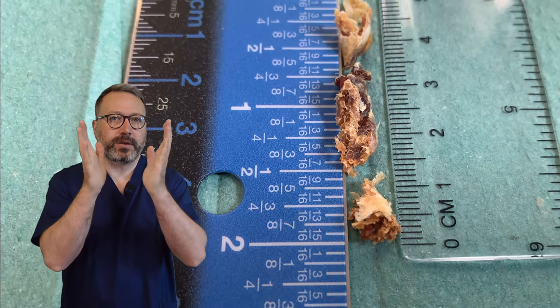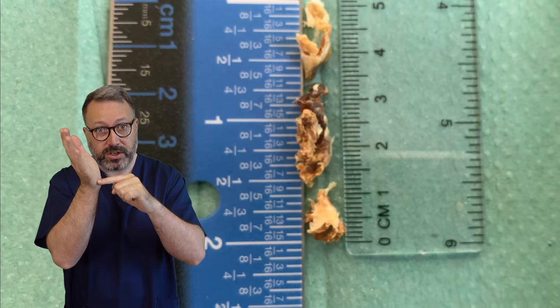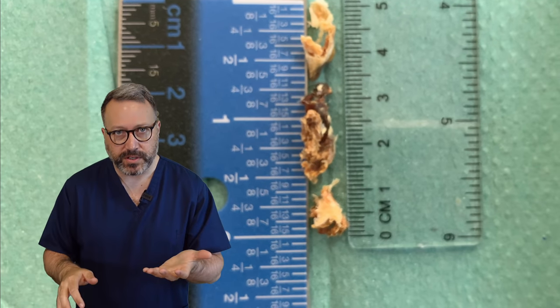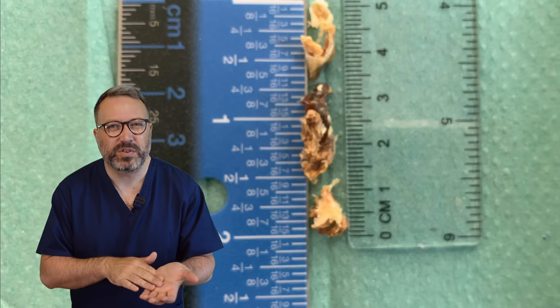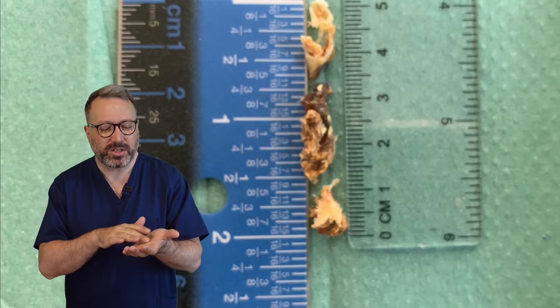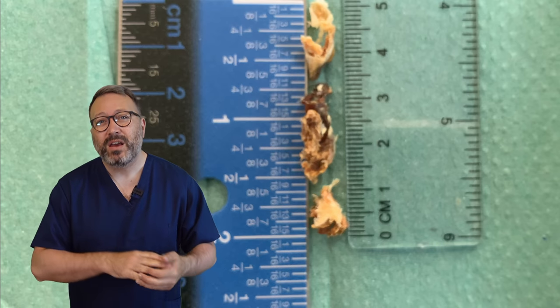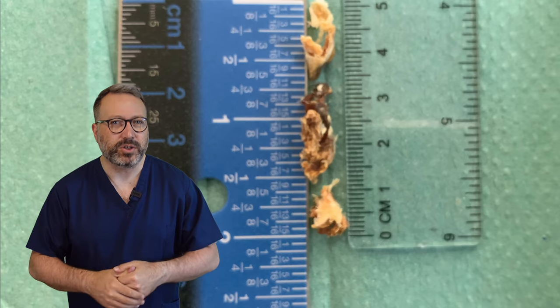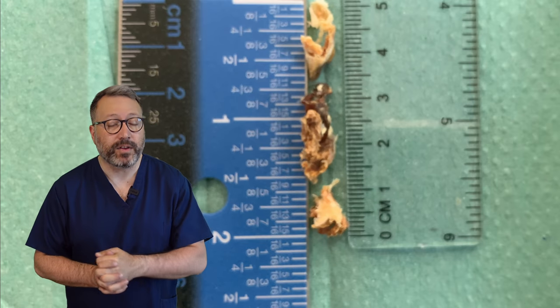The redness on the two sides — you've got the anterior recess there. Basically that redness is where we haven't broken the surface of the skin. It's almost like a very, very mild version of a blood blister — just on the surface. It's not going to run any risk of infection. We would obviously monitor this gentleman as well — he'll keep his ears dry for 24 hours after the procedure and everything will settle down quite quickly. Very, very relieved to get that out.